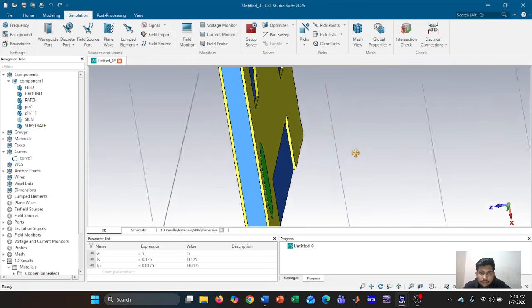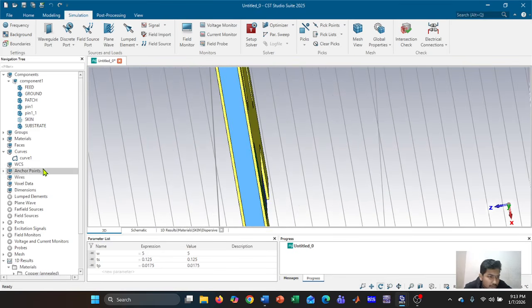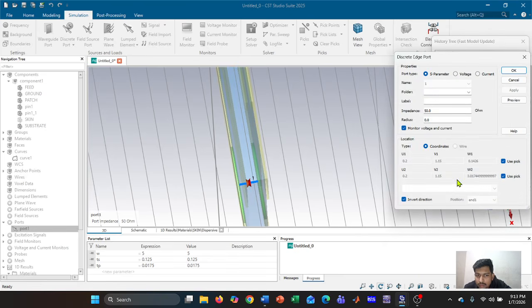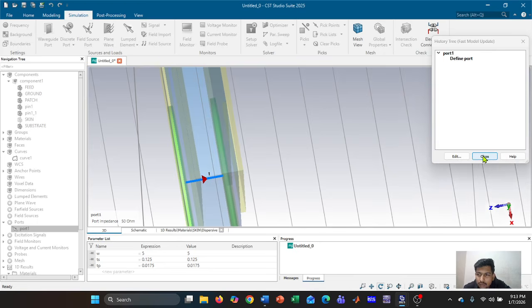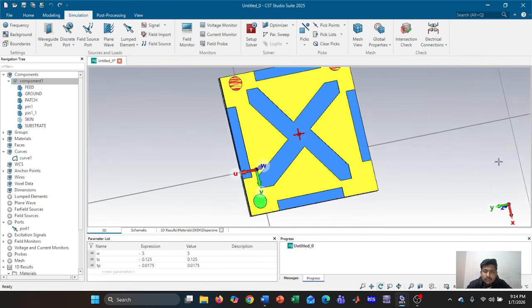Okay, I think need to change the direction of the port. Yes, the port. Yeah, edit, define port, invert direction. Okay, invert direction. Okay, so our antenna is complete. It's pretty easy.